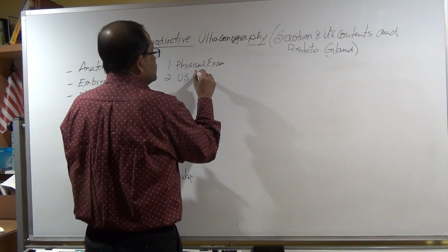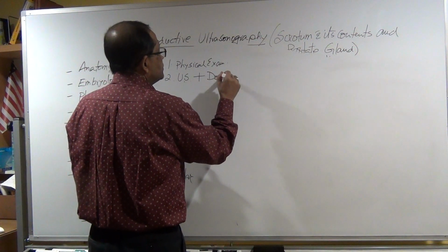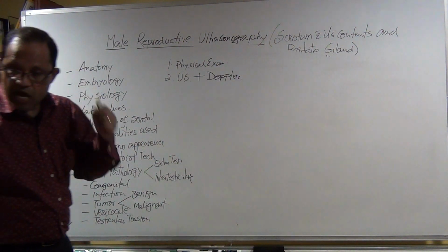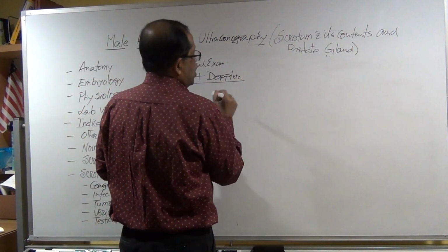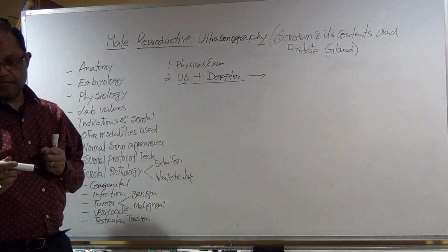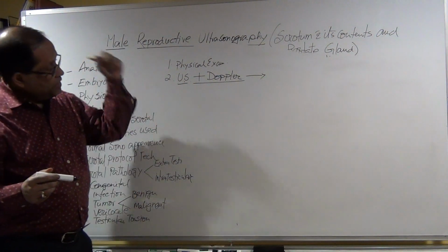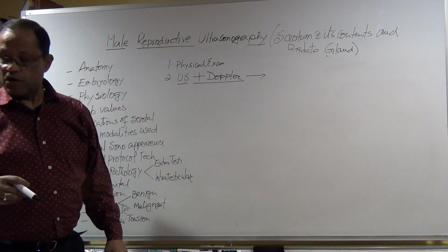Ultrasonography we do with Doppler. Most of the time, 95% of the time, ultrasonography with the Doppler can give you the answer, what is the pathology, even if the testis is torsion.